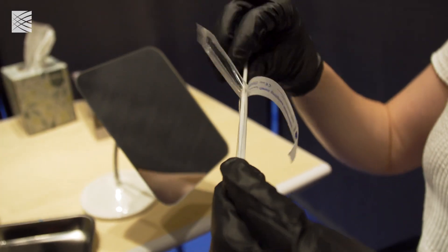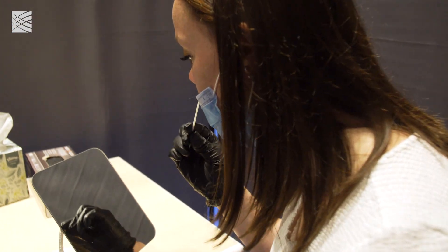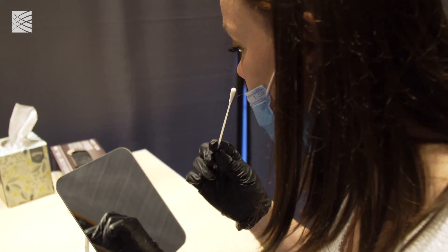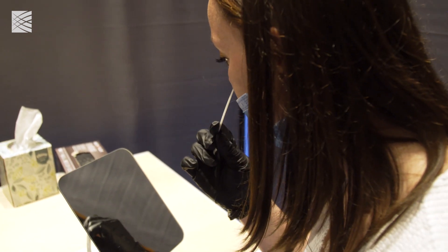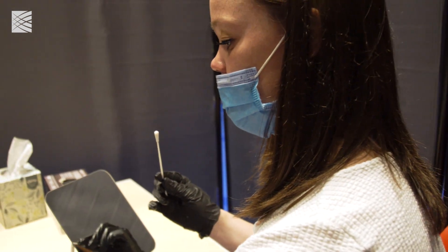The testing we've developed here is just an anterior nasal swab collected dry, so it's not put into a buffer. It's just the front of your nose — just a Q-tip, barely inserted into your nose, swirled around four times. We do it every single day here for ourselves. It's completely non-invasive, and it's super fast and easy.